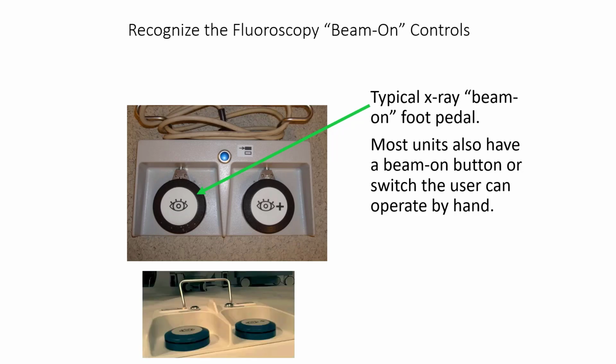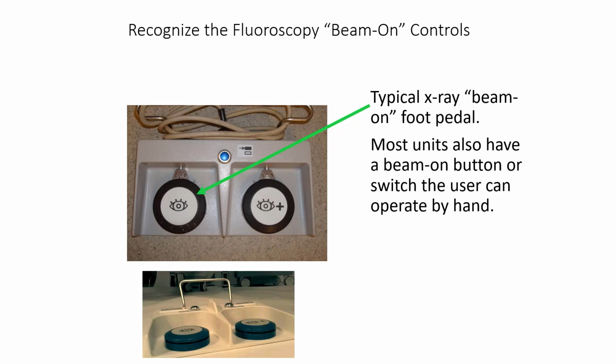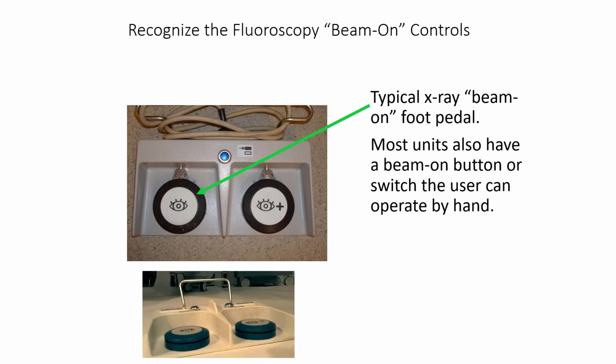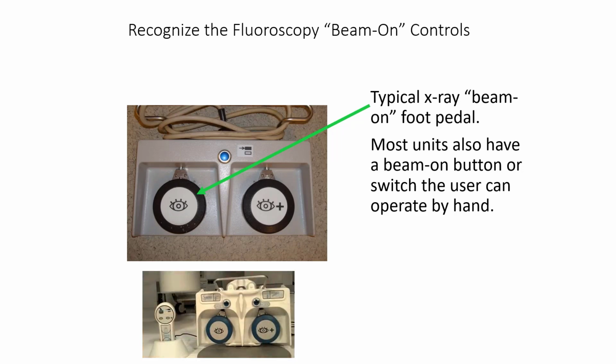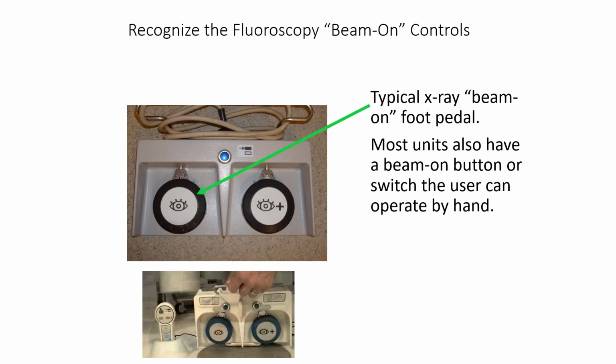They also need to look at the magnification views that they use. When you use mag views, you increase the exposure. We have two different pedals. If you step on the wrong pedal, you're boosting the exposure for a mag view. So again, understanding your equipment, how it works, and having your surgeon understand how the different components that they interface with work make a difference in radiation safety and patient safety.